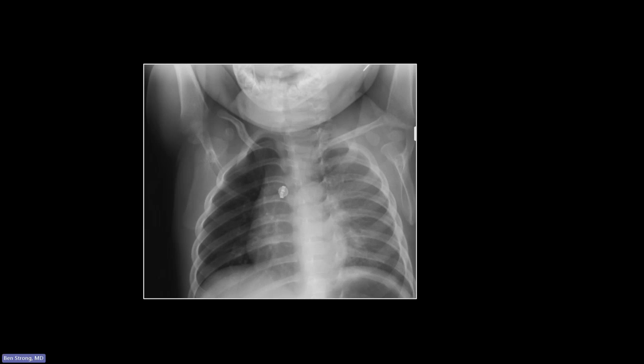So it can be really confusing. If in doubt, the one thing you can always do is obtain lateral films and decubitus films, and put the lucent lung down to see if it deflates, which usually means it's the normal side.